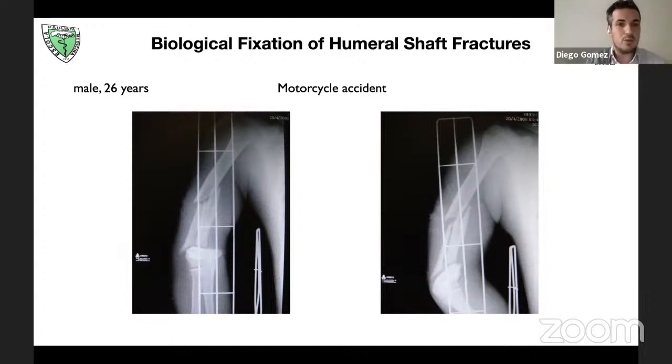Again, I would agree with the importance of measuring and understanding the distal humerus fracture. It could be with a CT scan, it could be with better X-rays, but it's important to choose a good treatment. And this kind of fracture, as I said, if it's isolated, I would think a little less in damage control. If it is in a polytrauma patient, of course, what you have done is perfect, it's beautiful. I would treat it with plates, and the type of plate depends a lot on the distal involvement. If you have a really short or intra-articular fracture, you may want to use distal anatomical plating. But if you have a considerable size distal fragment, you may use LCP plates, or any straight locking plates, and I think with Belangero's technique you can handle it.